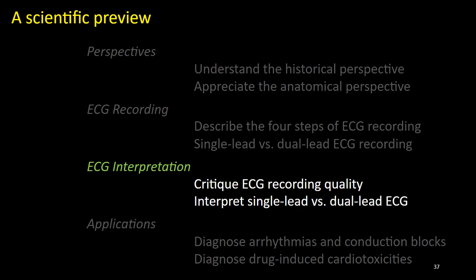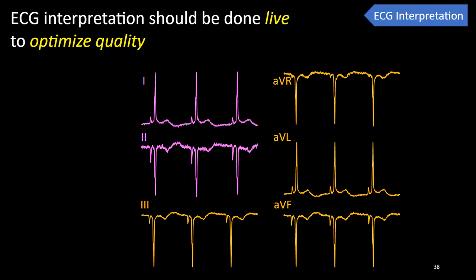But what can we do to increase signal amplitudes? Due to biological variations in how the heart hangs inside the fish chest, which in turn affect orientation of the heart axis, lead repositioning may be needed to align the leads with the heart axis to maximize voltage amplitudes, particularly of the T wave, which is notoriously the smallest of the 3 fish ECG waveforms. And the best chance to optimize lead positioning is during live ECG interpretation of initial ECG traces.